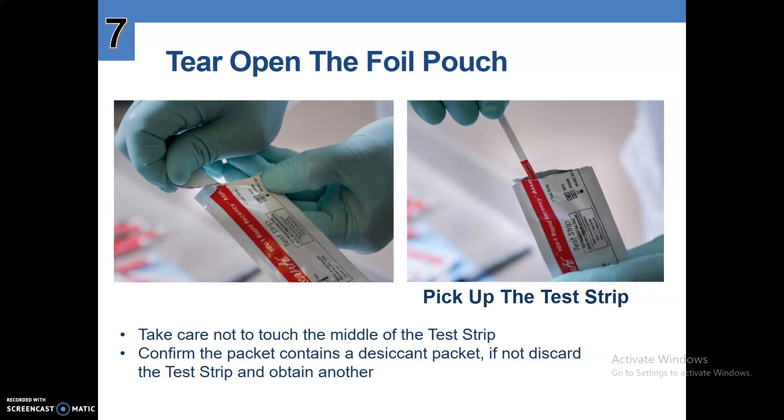Number six, tear open the foil pouch. Pick up the test strip. Take care not to touch the middle of the test strip. Confirm the packet contains a desiccant packet. If not, discard the test strip and obtain another.